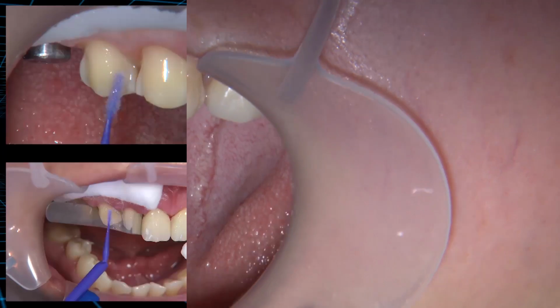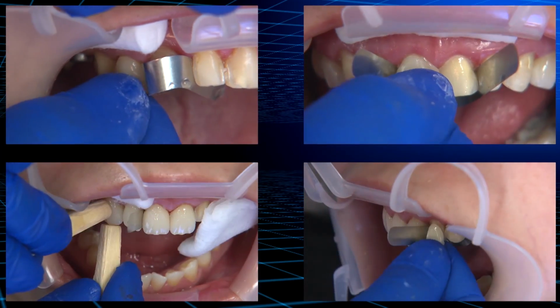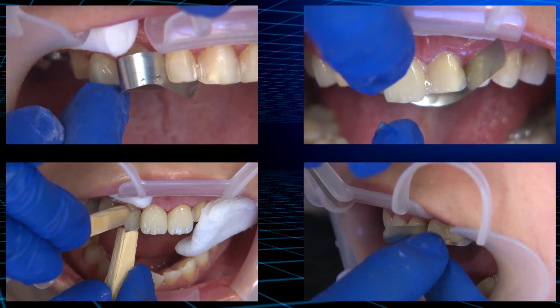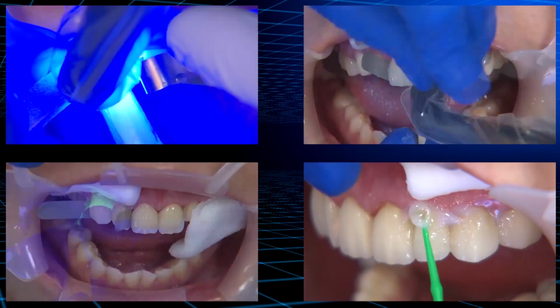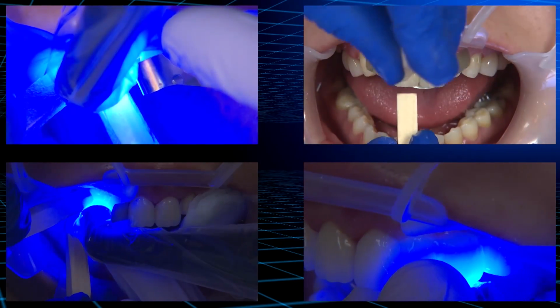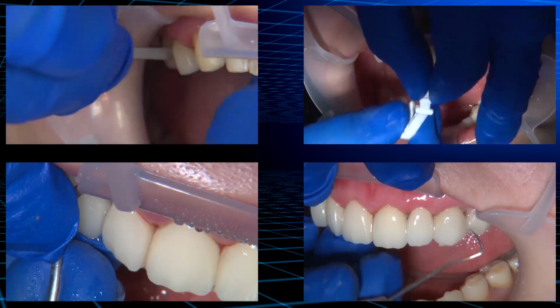With an average biaxial strength of 397 megapascals, Obsidian Lithium Silicate Ceramic exceeds the strength requirement for all-ceramic restorations, making this material a good choice for this case because the veneers were extended posteriorly to the maxillary premolars.